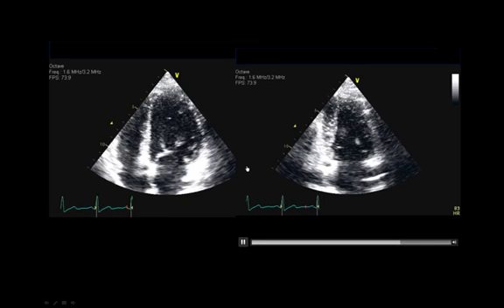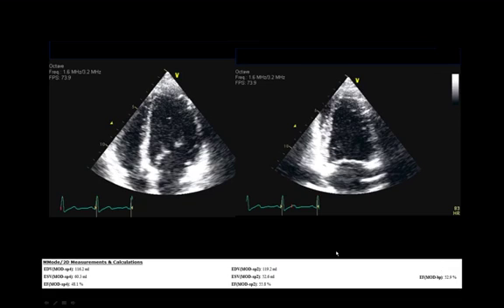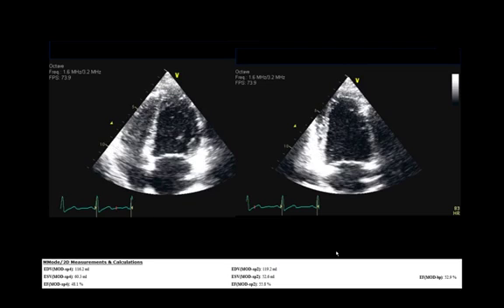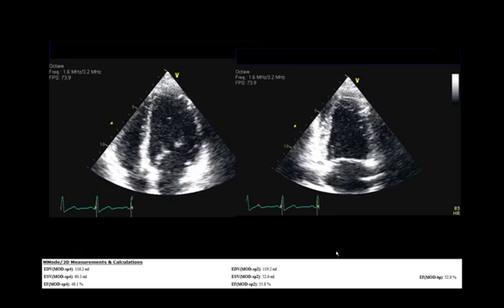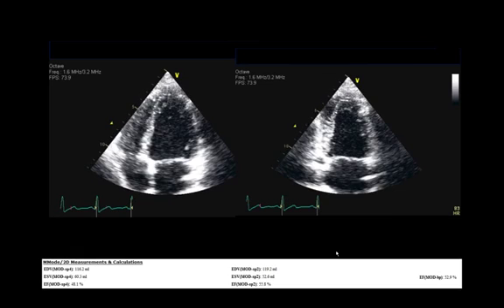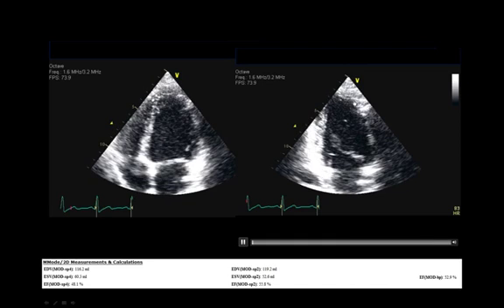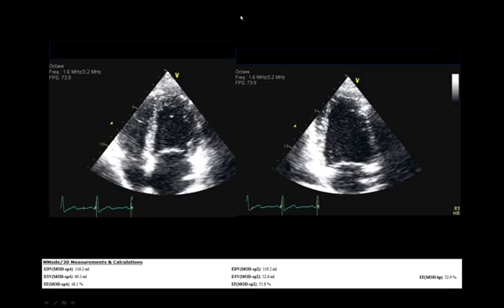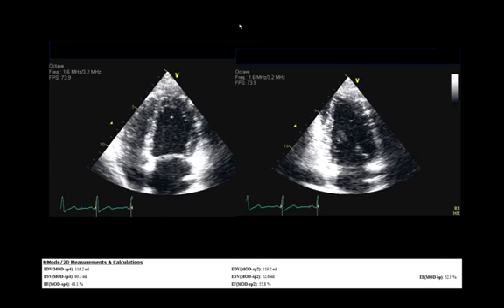and so we here actually give her therapy. These views, I admittedly, are a little bit foreshortened, but her ejection fraction had increased to 52. I saw her again yesterday and did a quick echo. Again, her ejection fraction yesterday was right at 50%. Unfortunately, couldn't get strain on her yesterday. She had gained quite a bit of weight from the last time we saw her, and I could not see the apex well. I tried and tried, couldn't get the artifact to go away, and the strain could not be obtained. So it's a big disappointment for me.